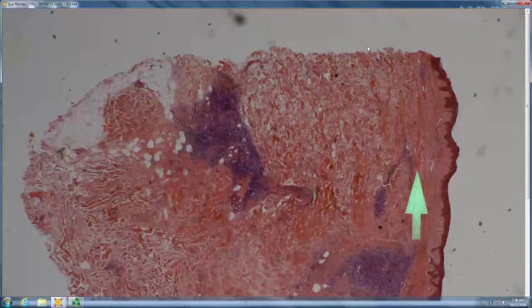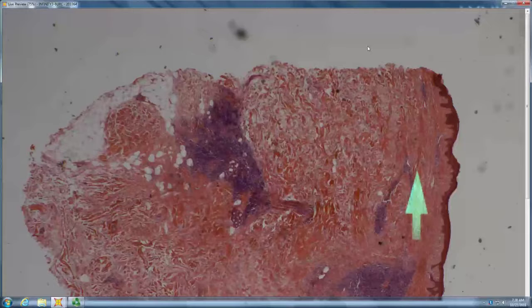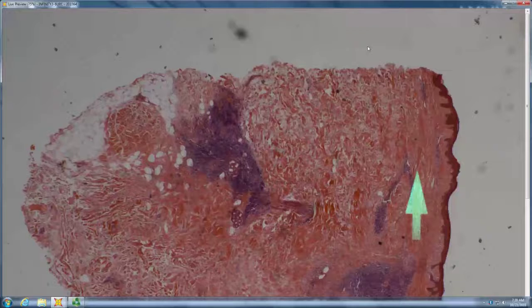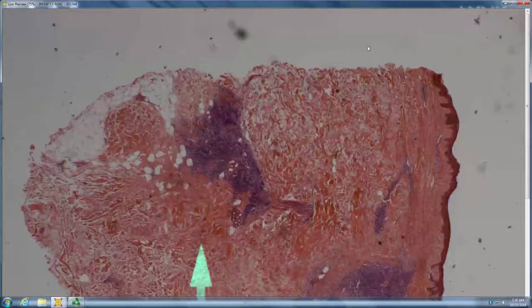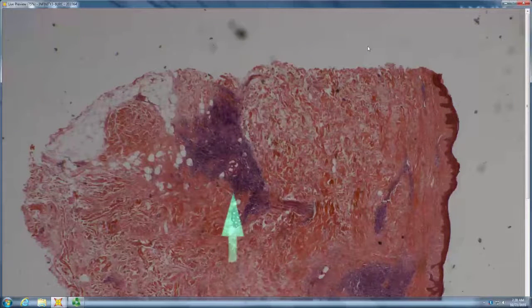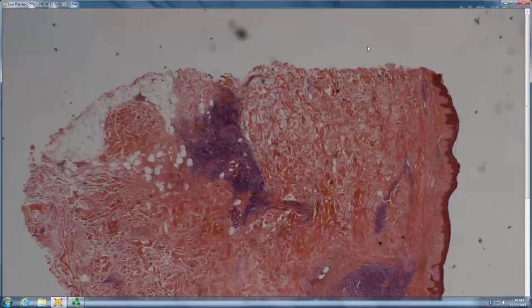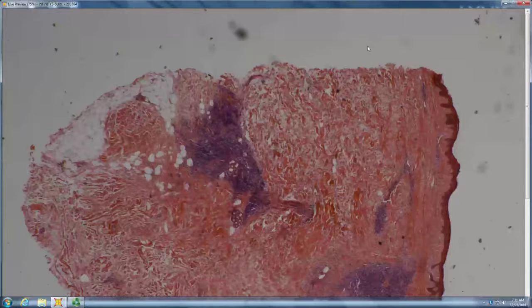So there is inflammatory infiltrate in the middle and deep dermis, and a little bit of sclerosis in the dermis also. So there is some sclerosis in the dermis. There are infiltrates. Is there anything they're associated with? Well, it's around hair follicles and also eccrine coils. So connective tissue disease would be reasonable.